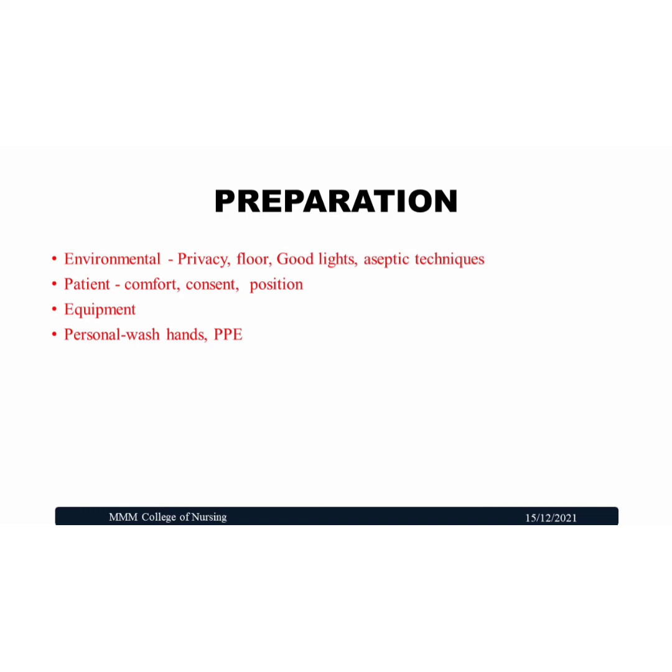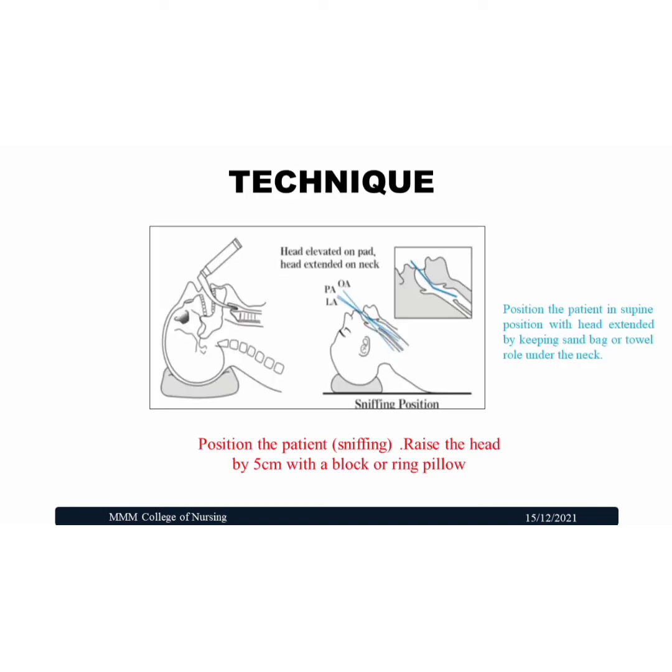Technique. First, position the patient, maintaining the sniffing position, and raise the head by 5 cm with a block or ring pillow. Position the patient supine with the head extended, keeping a sandbag or towel roll under the neck.